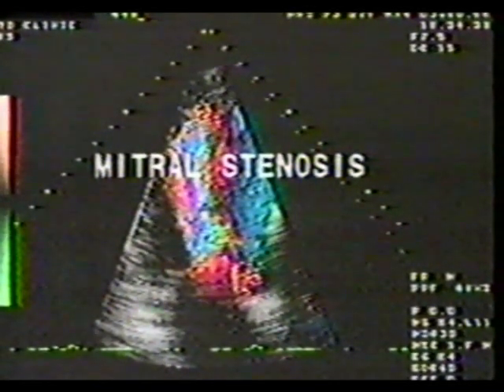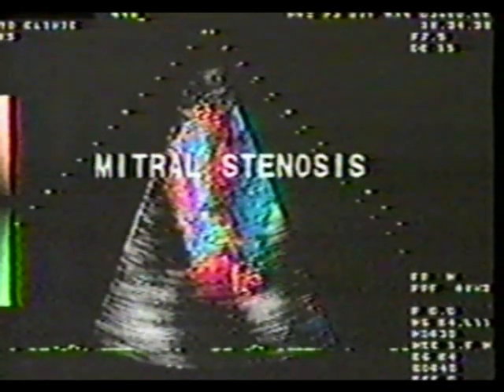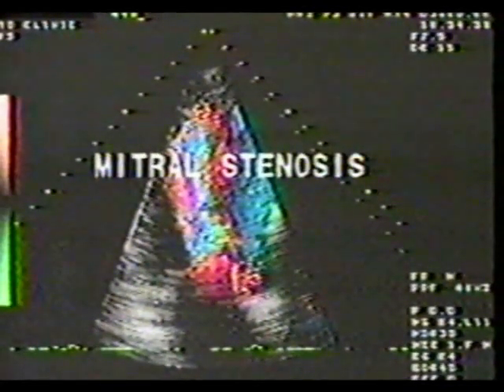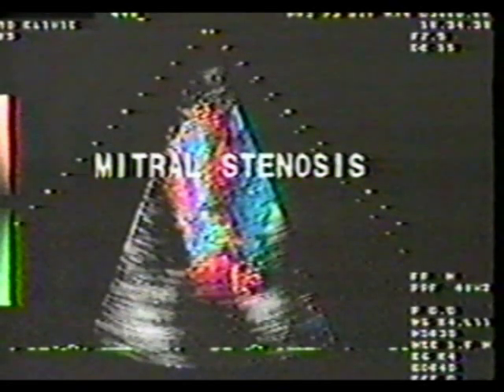Traditionally and historically, echocardiography has enjoyed the status of being the gold standard for the diagnosis of mitral stenosis. With the addition of Doppler and flow imaging, the hemodynamic severity can also be confidently determined.